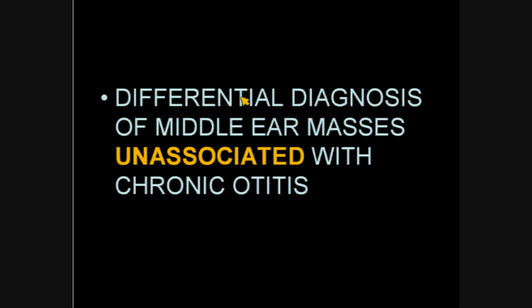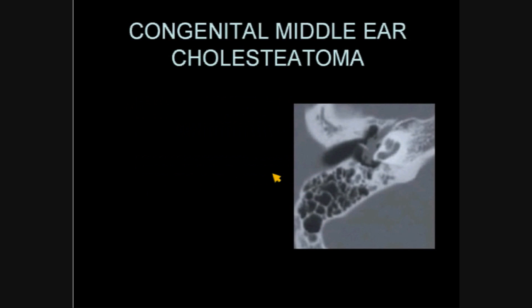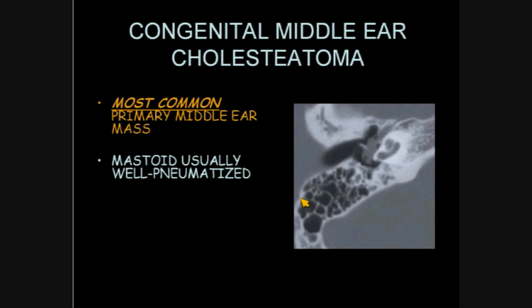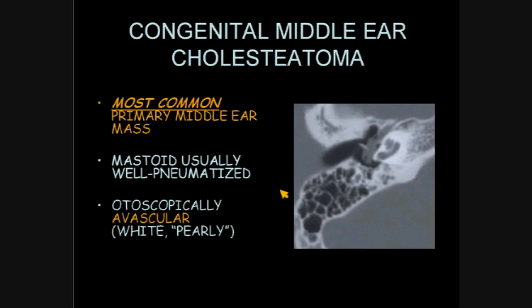We're going to talk briefly about a few cases — differential diagnosis of middle ear masses which are unassociated with chronic otitis. First is the congenital middle ear cholesteatoma, which we have an example of here. This is the most common primary middle ear mass. The mastoid is typically well pneumatized because these patients do not ordinarily have a history of chronic otitis, and they're otoscopically avascular, usually described as white or pearly.